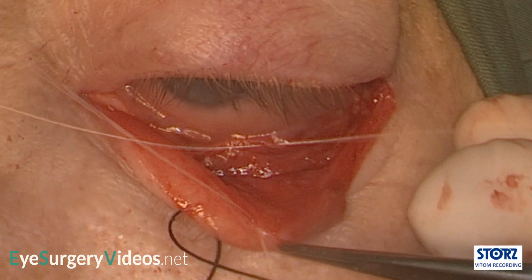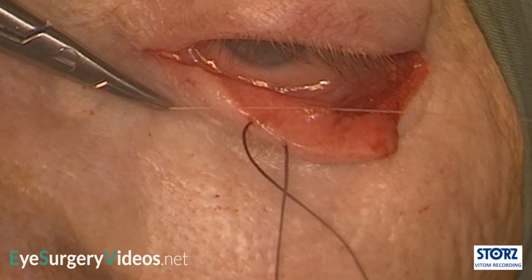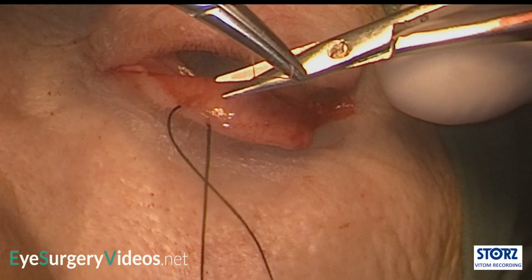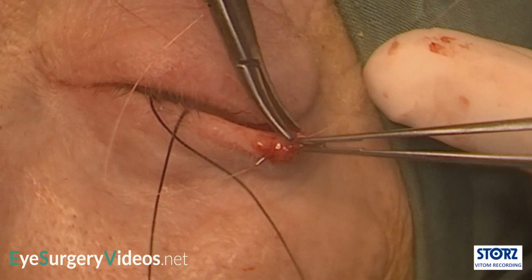Less is probably more with closure. The periosteum can be closed over the orbital rim. This may provide an additional barrier to extrusion, although extrusion tends to occur later when the defect would have healed irrespective of whether sutures have been used, and is probably more related to poor placement or an excessively large implant.